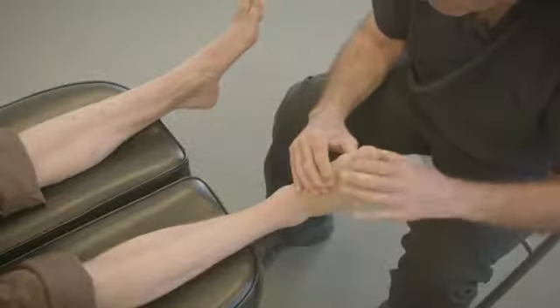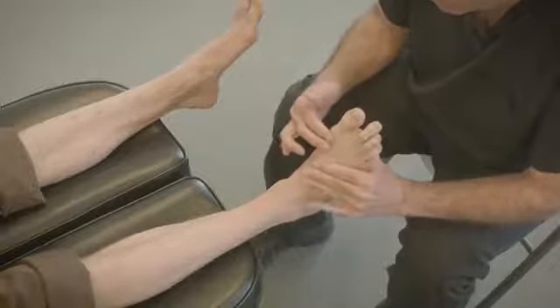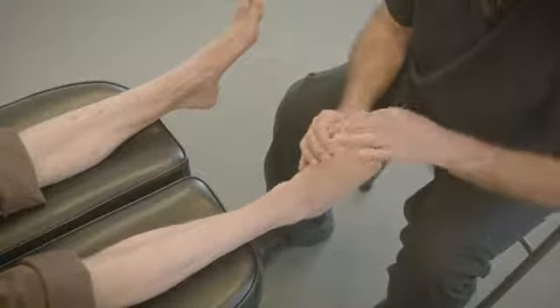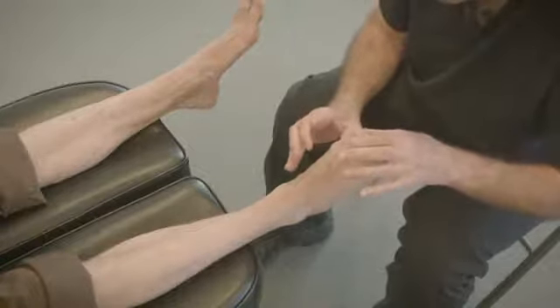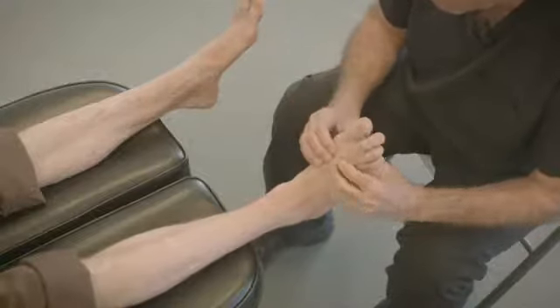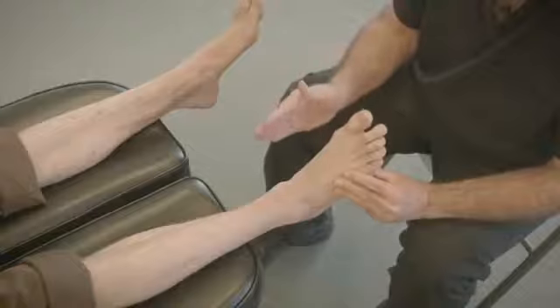So when your foot is pronated, that big toe only moves this much. But if I correct your foot and support it here, this bone can come down. If I support this part of your foot and let this bone come down, here's your range of motion. So look at the difference of this range of motion compared to this range. So ideally, we're going to support your foot and make this part of your foot drop to the ground more efficiently and let your big toe move normally. That's what a true custom functional foot orthotic will do for you.